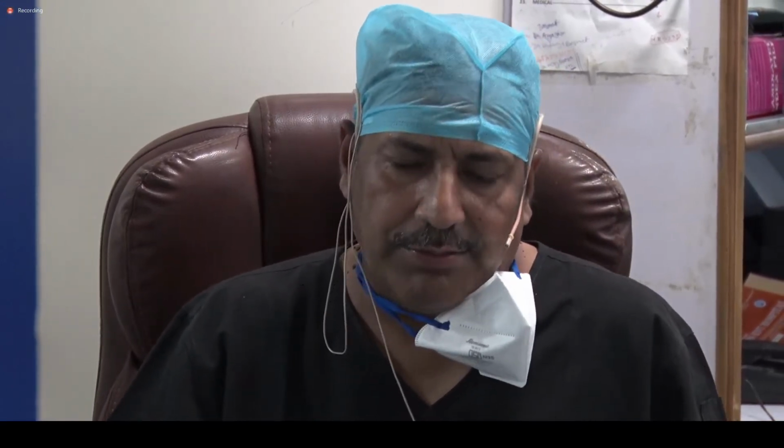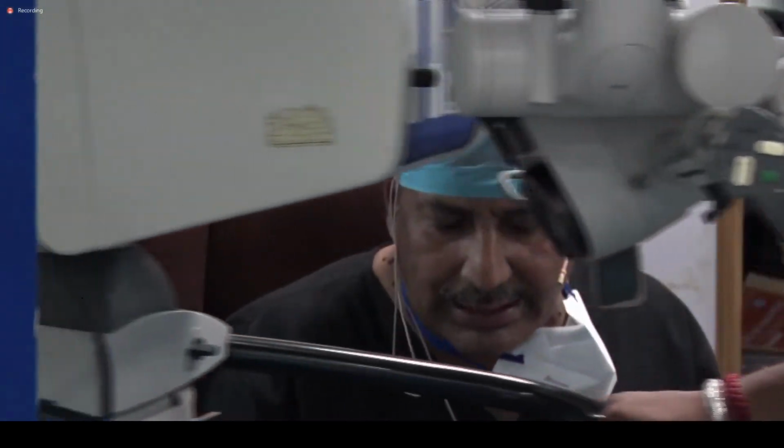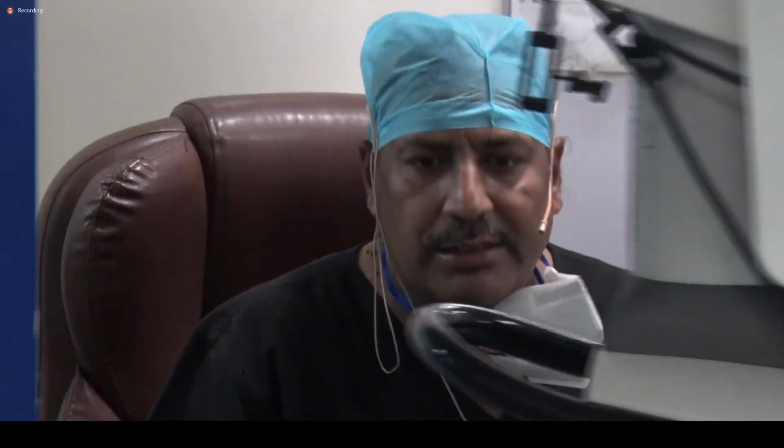Coagulation you can use on perimysium because still the muscle is underneath the perimysium. So everywhere the perimysium was intact, nowhere the muscle was exposed. That's the beauty of this technique. It calls for more time than usual. It calls for more patience. It calls for more equipment. But at the end, the outcome is amazing.